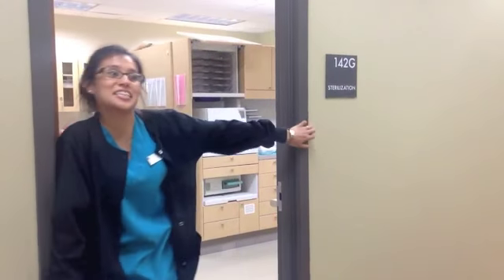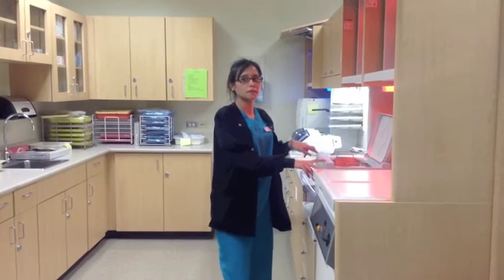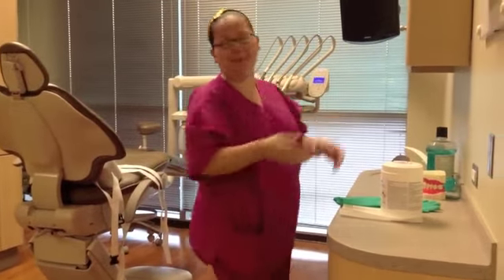Okay, so after the treatment room, we're going to come to the sterilization room. In the sterilization room, we are going to check the levels of the solutions. Room, and we're going to do an in-depth cleaning of the treatment room.